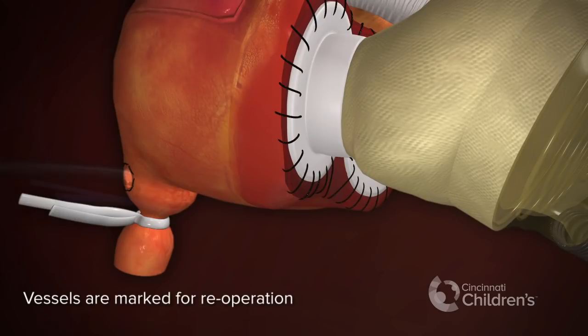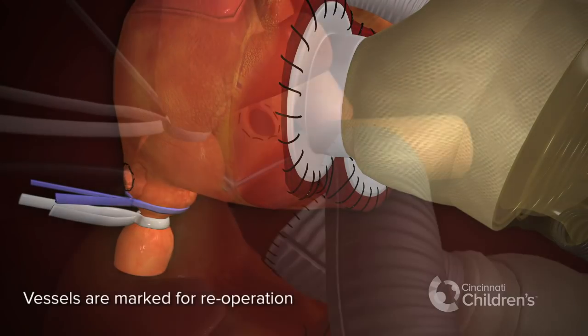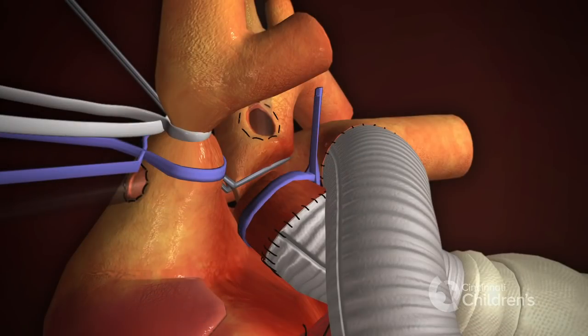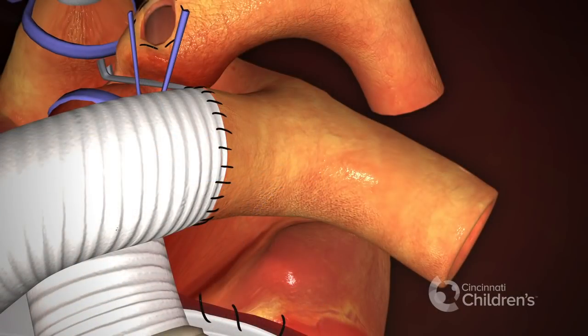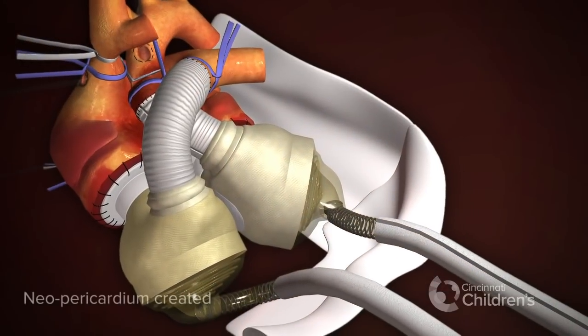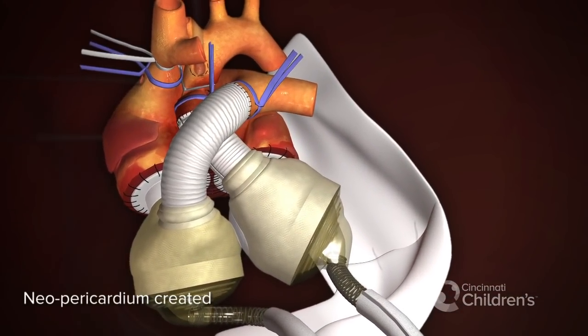Vessels are marked for re-operation, including the inferior vena cava, the superior vena cava, the aorta, and the pulmonary artery, with a loose-fitting silastic loop. The neopericardium is completed.